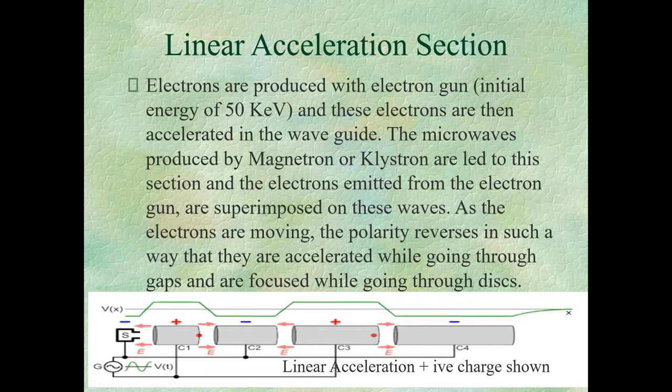So when this electron pencil beam strikes the target, it produces high energy X-ray beams through the Bremsstrahlung process. Characteristic X-rays are very low energy X-rays. So we are looking at the Bremsstrahlung process here. And this is a German word, so my pronunciation may be wrong. We pronounce different things very wrong when they are German.